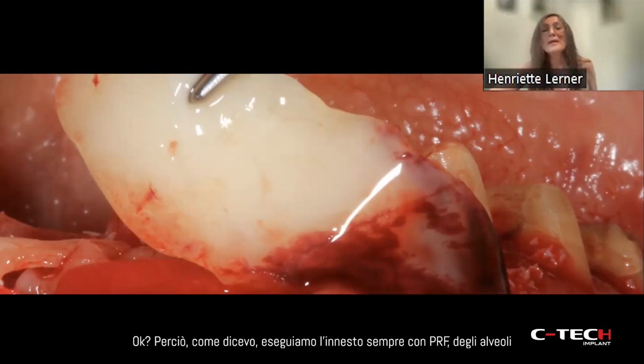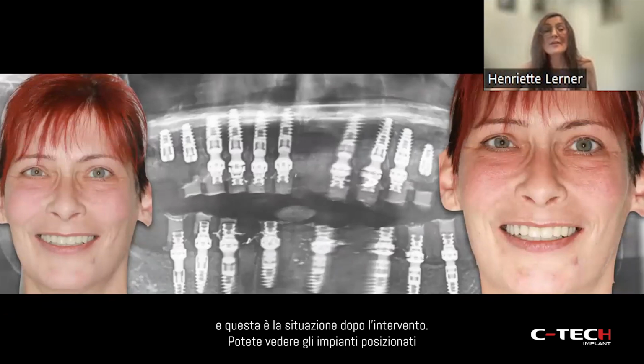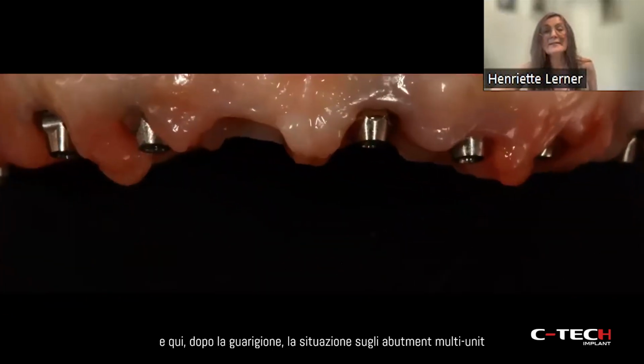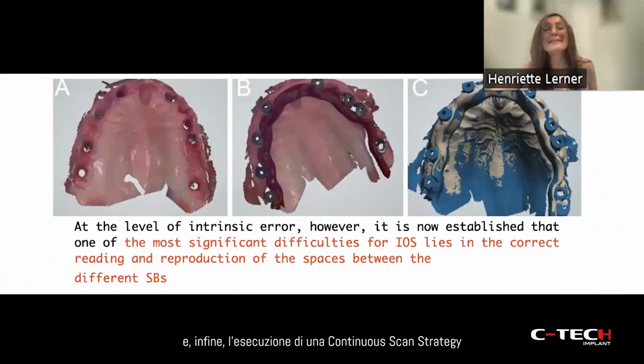Okay, so as I said, we graft the sockets also with PRF, and this is the situation after the surgery. You have implants placed in the sinus area, which you don't load because you don't have the possibilities or the opportunities there. This is the provisional, and here is after the healing, the situation over multi-unit abutments, and the final, where we do a continuous scan strategy over the scan bodies.